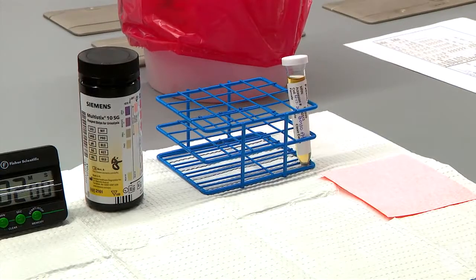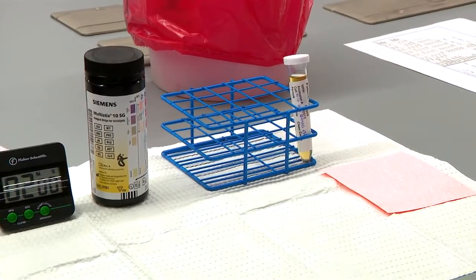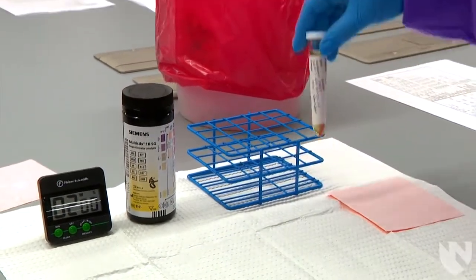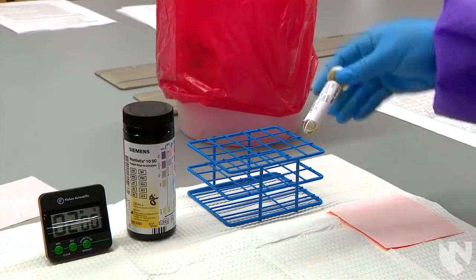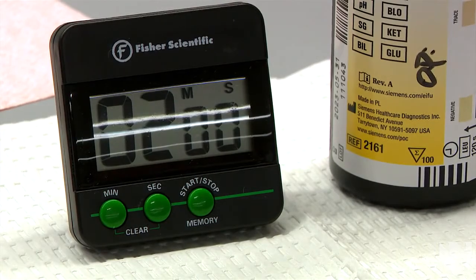The specimen is mixed before being poured into the conical tube, but if the sample sits for an extended amount of time, place a lid on the conical tube and mix the urine before testing. Prepare your timer. I prefer to use a stopwatch, but you can also set a timer for 2 minutes or watch the clock. The chemical reaction begins as soon as the reagent pads are wetted by the urine.